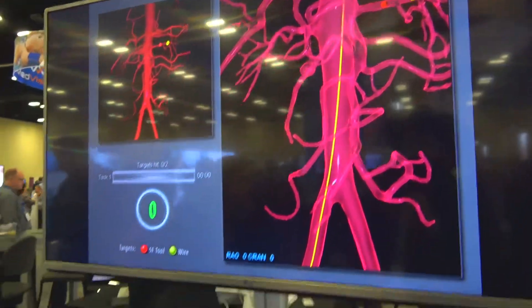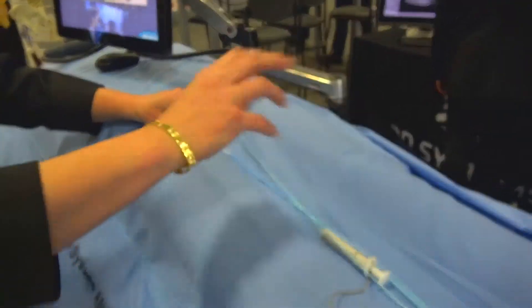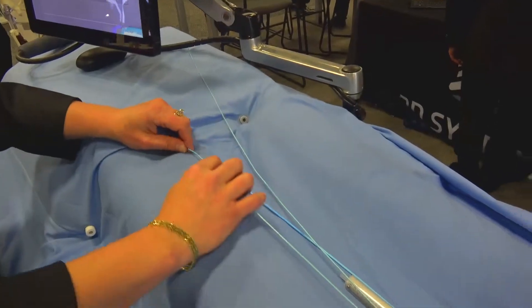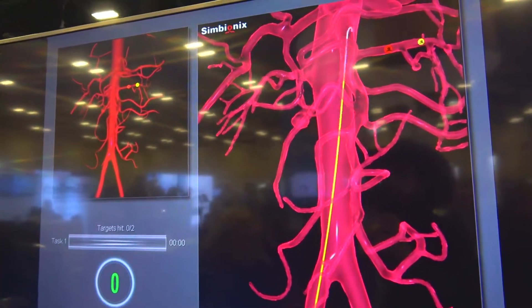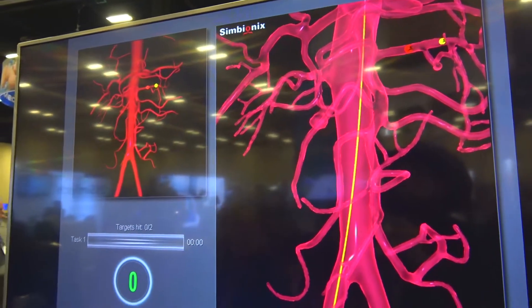Hi, my name is Amy with 3D Systems and we're here at IMSH 2019. We're showcasing some of our new products, one being the Angio Mentor Suite with our basic skills. We have endovascular basic skills, cardio basic skills, EP basic skills and C-Arm, and we also have now incorporated the TEE into the mannequin.